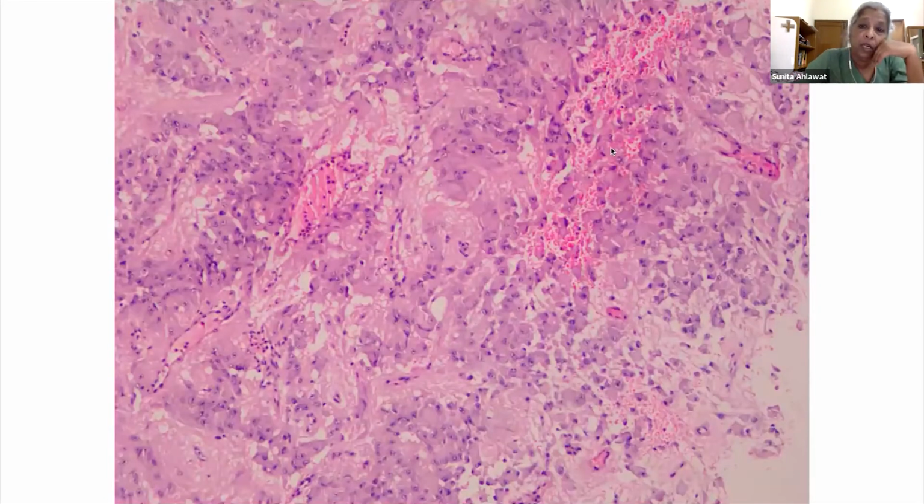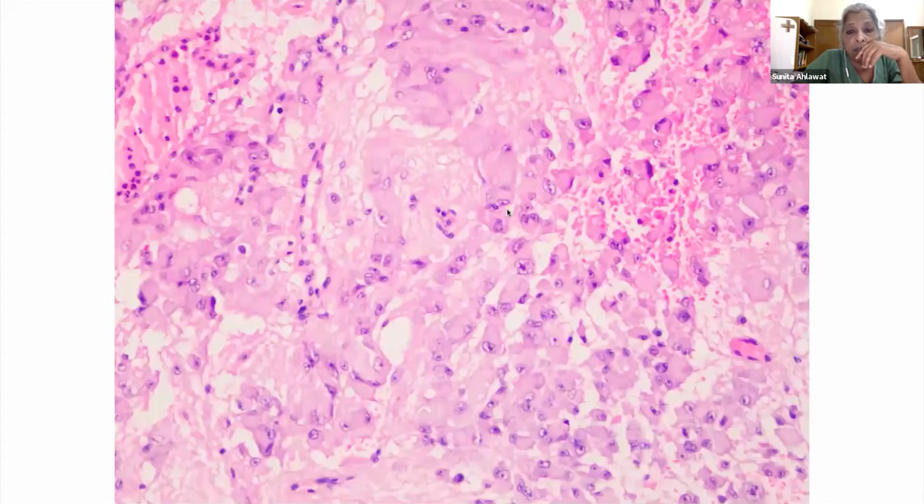And the tumor showed hemorrhage, and this is full of these pink cells with large nucleus, very glassy cytoplasm, and a very distinct nucleolus. See the higher part.